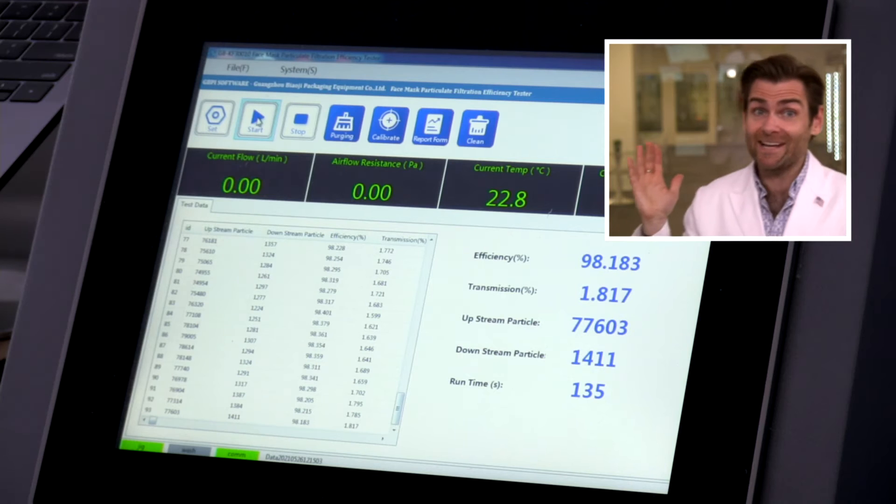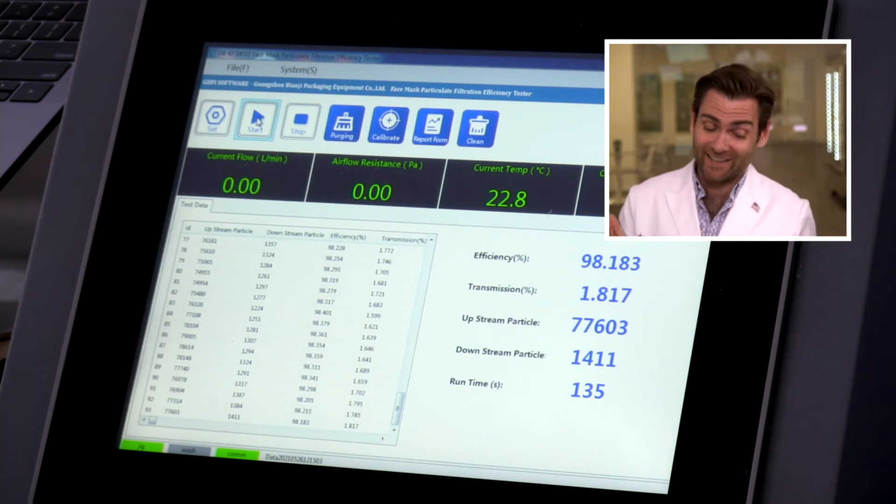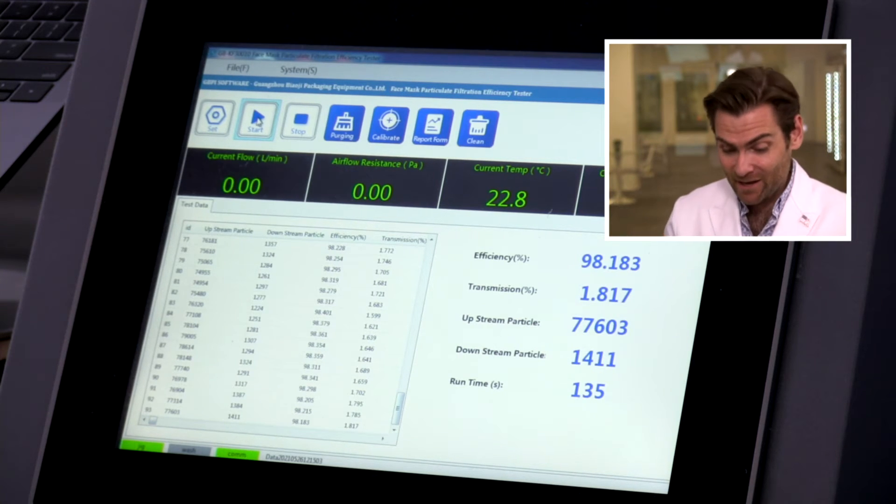Typically KN95s have pretty good ear loops — yeah, I don't think it's going to fall off your face. The ear loops are really good. But does that matter if it doesn't protect you? Let's check what the machine says. 98%! I've got to admit, that's a pretty good mask.